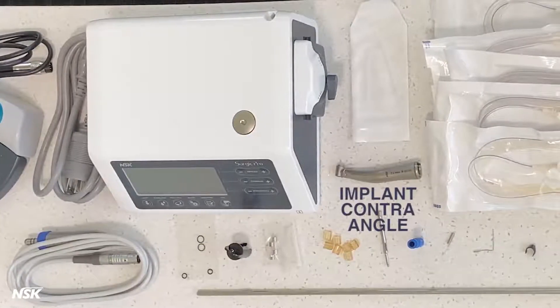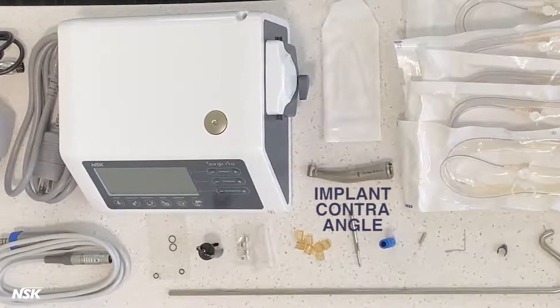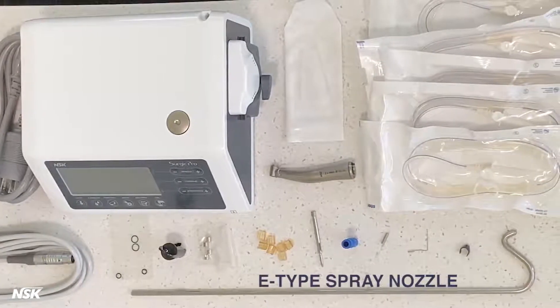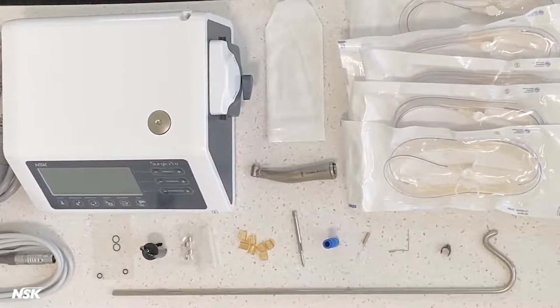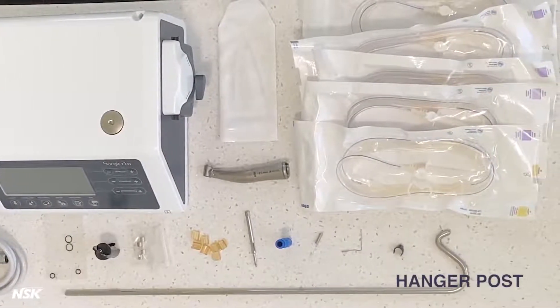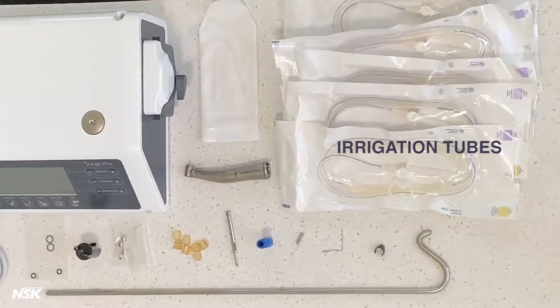Also included: optic or non-optic implant contra angle depending on the model of the motor, Y connector, E-type spray nozzle, cleaning wire, internal spray nozzle, nozzle holder, coolant solution hanger post, and irrigation tubes.